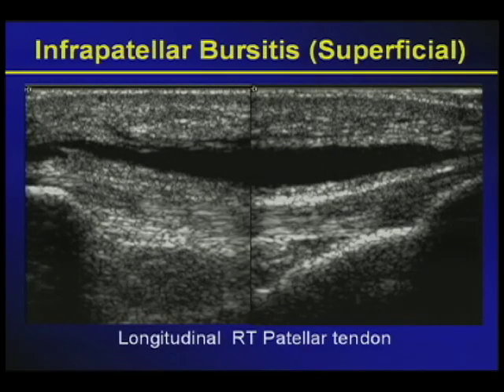This is a great case to illustrate why sometimes in the ER it's very difficult to identify if the patellar tendon is intact because of the overwhelming soft tissue swelling, as you can see here. Here in hemobursitis, not only is the superficial infrapatellar bursa distended with uncomplicated fluid, but also it tracks all the way to the prepatellar bursa itself. But clearly you can appreciate that it's all extraarticular subcutaneous and does not affect the intact patellar tendon.